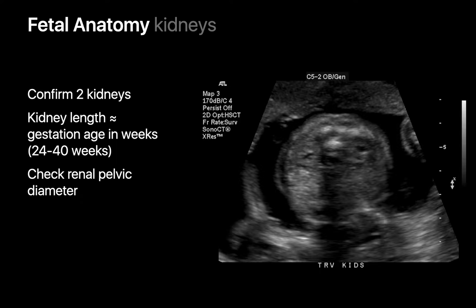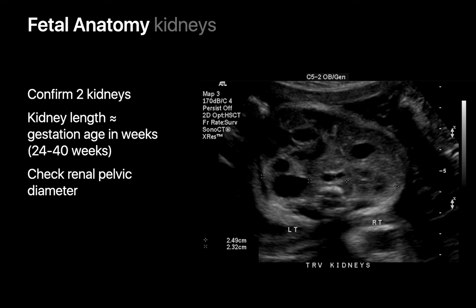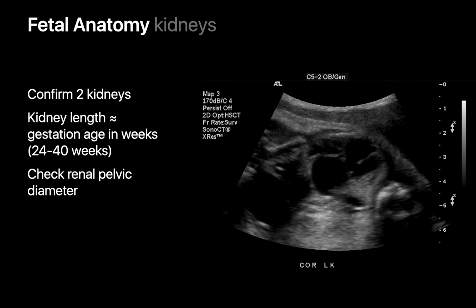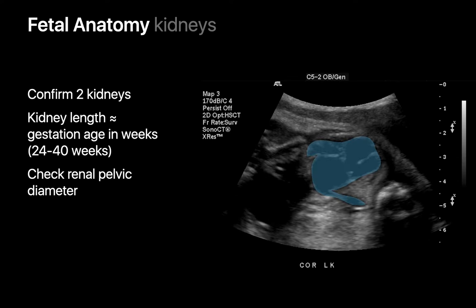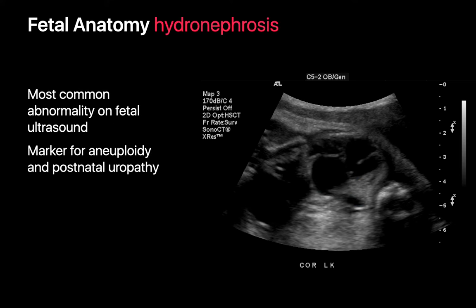Our assessment of the kidneys begins by confirming that two kidneys are present. We measure the lengths of both fetal kidneys and the diameter of both renal pelvices. In this example, the left renal pelvis is markedly enlarged on transverse and coronal images. Fetal hydronephrosis is the most common anomaly we'll encounter on fetal ultrasound and is sometimes a marker for aneuploidy. It usually occurs because something is preventing the free flow of urine downstream from the kidney.